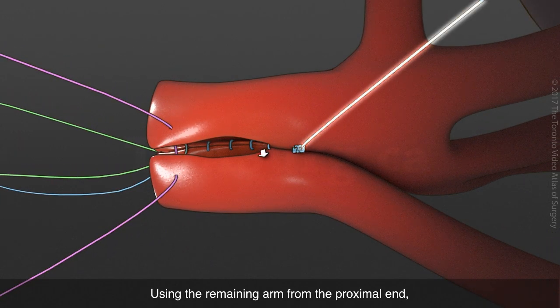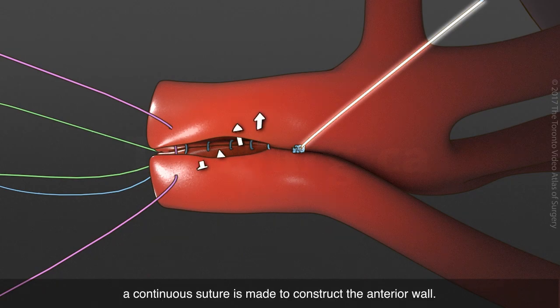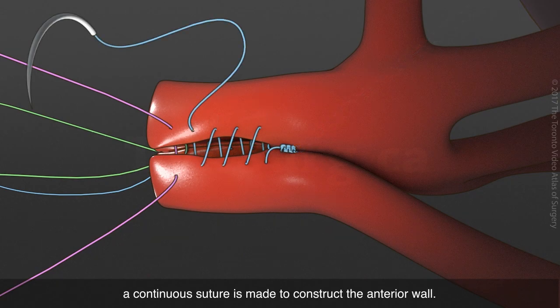Using the remaining arm from the proximal end, a continuous suture is made to construct the anterior wall.